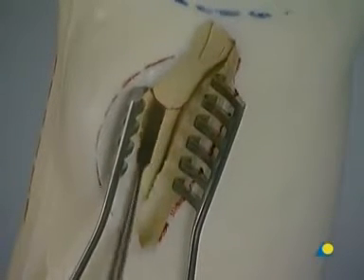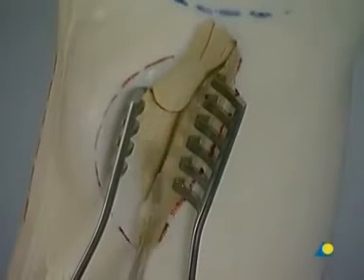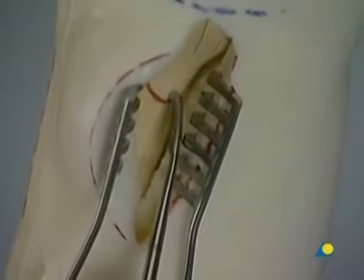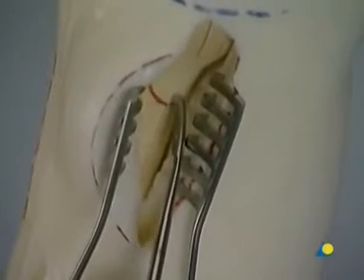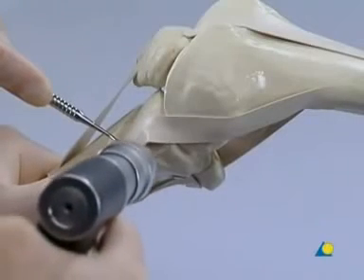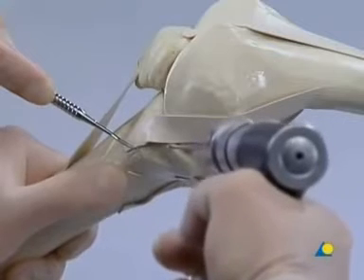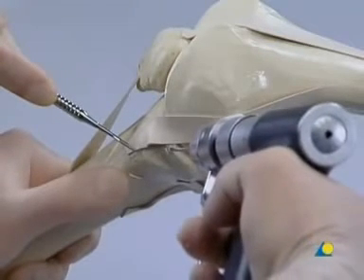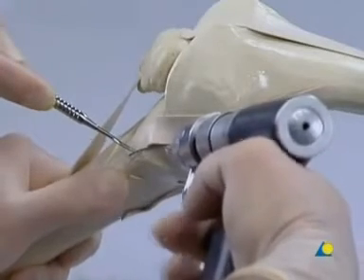After clearing the fracture gap, a reduction is achieved by pushing the medial bone block upwards. Preliminary fixation is done by inserting a K-wire. This preliminary fixation is begun close to the joint surface. Then the K-wire is angled downwards, so that it ends in the tibial shaft.